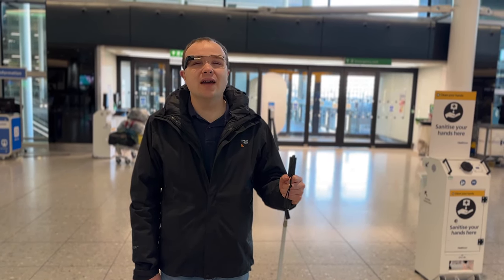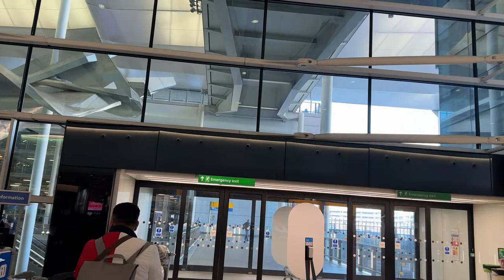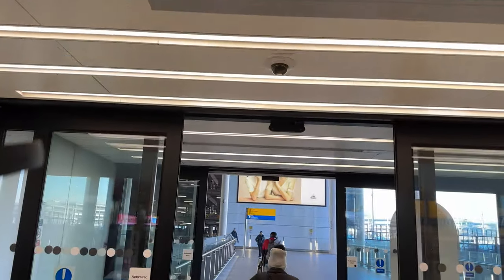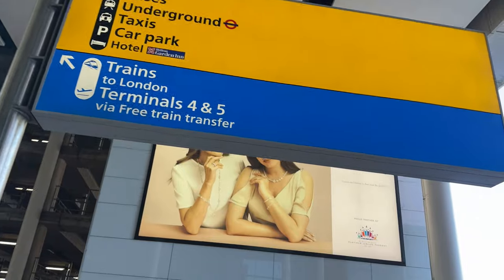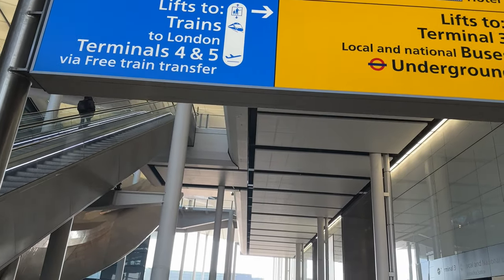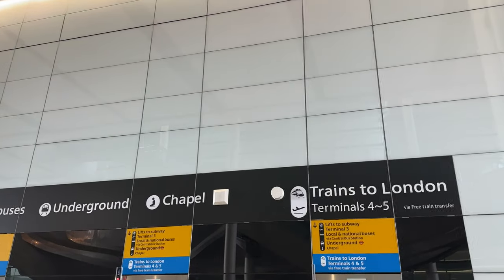It's important to make clear that there are two modes: offline mode and online mode. The online mode requires an internet connection and whilst it can be a little more accurate, it can be a little bit slower as well. [Live demo — glasses reading signs]: Sanitize your hands here. Cash ATM. Travelex. Emergency exit. ATM. Cash. Emergency exit. Automatic door. Final three. Trains to London, terminals 4 and 5. Heathrow trains to London, terminals 4 and 5 via free train transfer. Underground. Drop off charge. Car parks, hotels, car rental buses. Lifts to trains to London terminals 4 and 5. Transfer, taxis, car park. Fast track. Hotel. Lifts to terminal 3. Local and national buses.